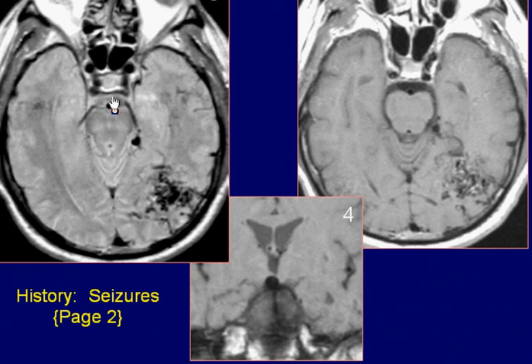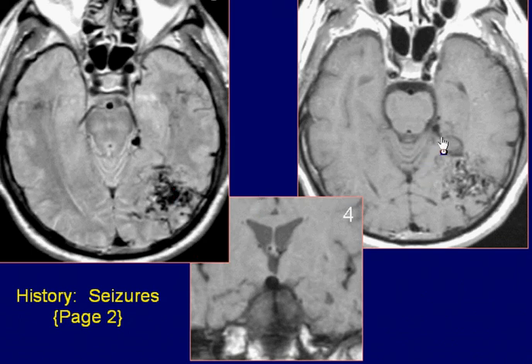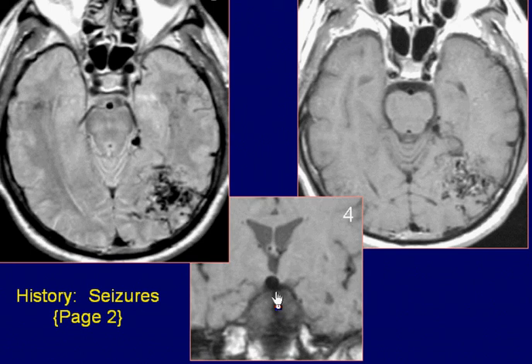Axial proton density and T1-weighted images demonstrate a serpentine flow-void lesion with supply from the left posterior cerebral artery. Coronal T1-weighted image reveals focal dilatation of flow-void at the tip of the basilar artery.